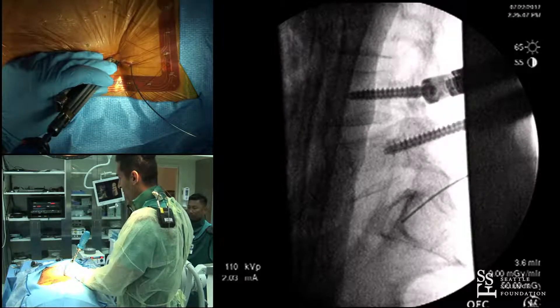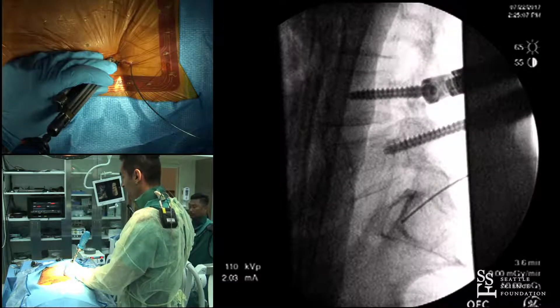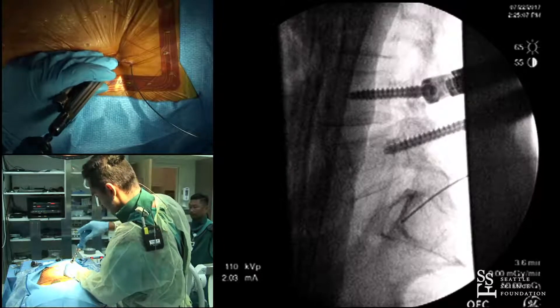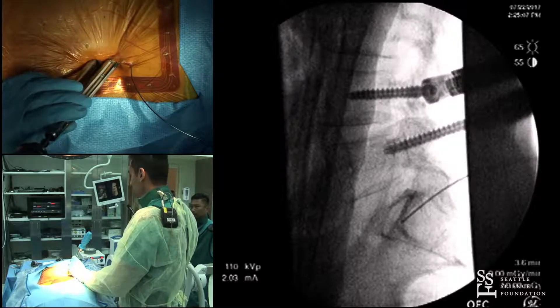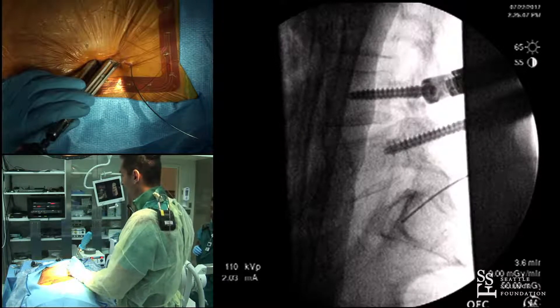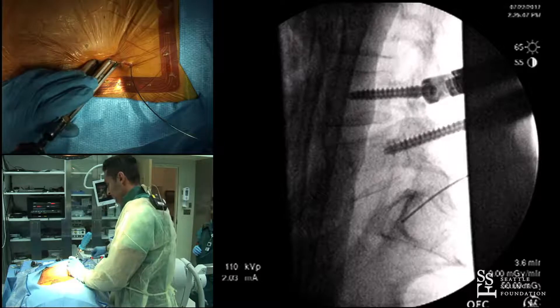I use a threaded K-wire tip and a powered K-wire driver. If you put the K-wire down, it prevents back-out because it's threaded — it actually pulls you into the cancellous bone with no pressure. I advance a centimeter at a time and it finds the center of the pedicle. On this one though, we have to tap this pedicle — it's not advancing.